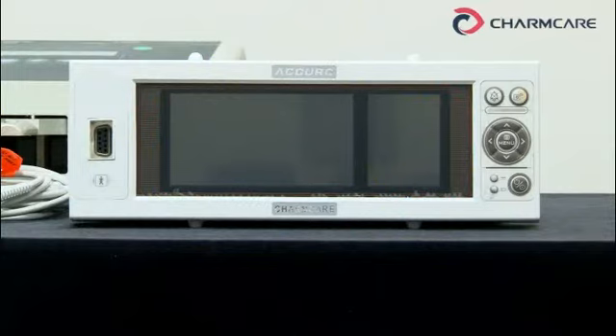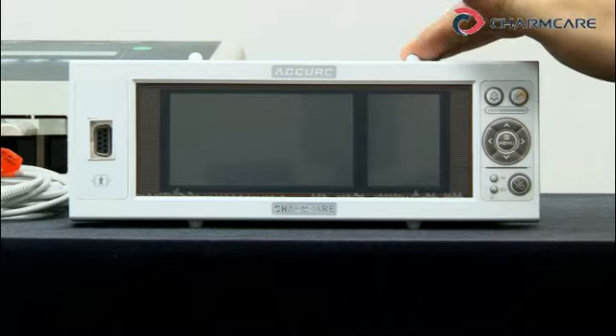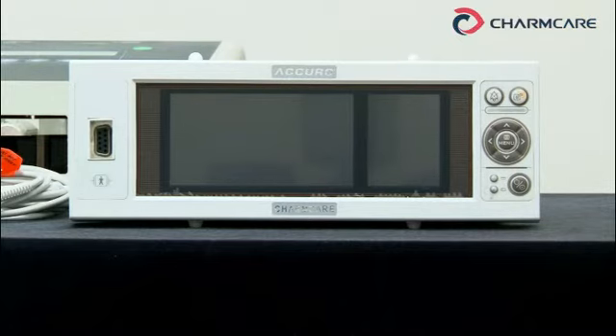Hello everyone. I'd like to give you a brief explanation on our pulse oximeter Acura. It's a desktop type now as you see, but it can be a bedside type if you combine the handle here. It's also portable, so good for emergency. It's widely used in ambulance too.